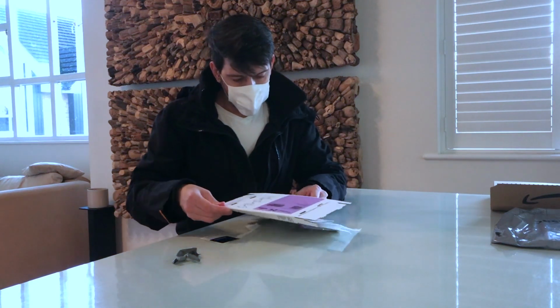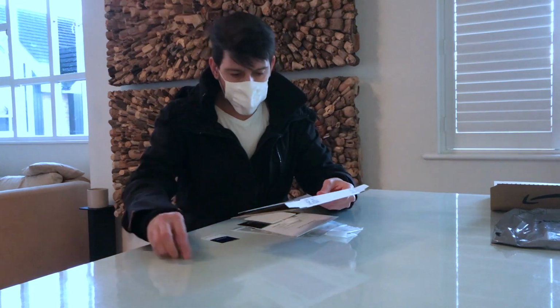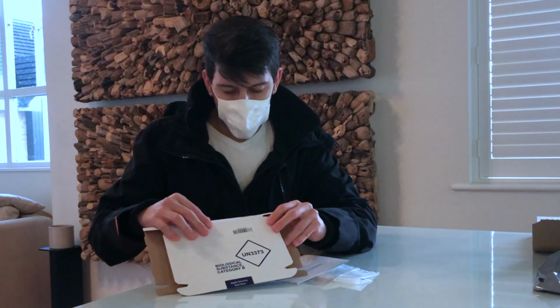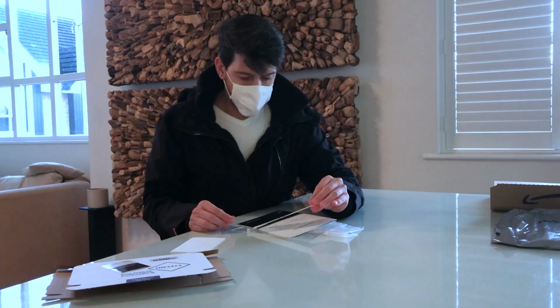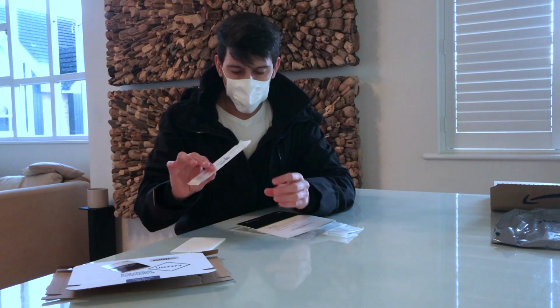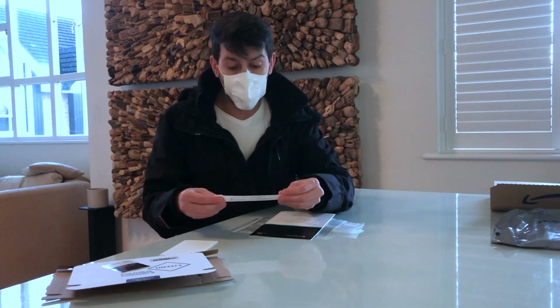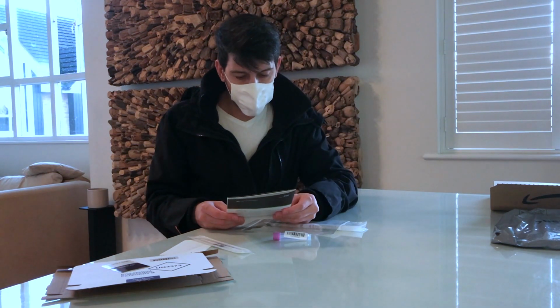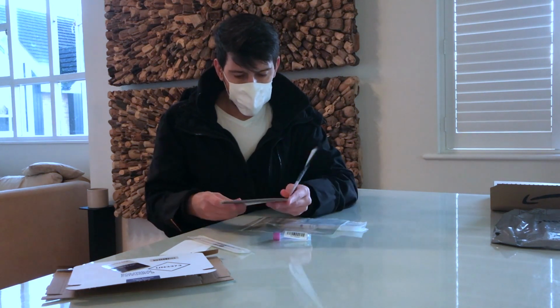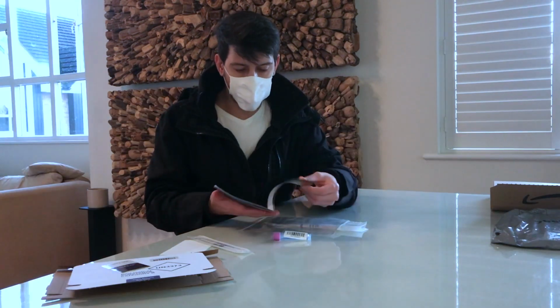Here, this is a package for you to send to them after you do the test. It says biological substance, category B, so they alert people from the mail that this is a test. Also inside there is a swab, so you can put it inside your nose or mouth. Let's see which way it will go. This is a swab test to check if you have coronavirus now. We have to put your name here, okay? I'll read the instructions and then show you guys later how it's going to be, okay?